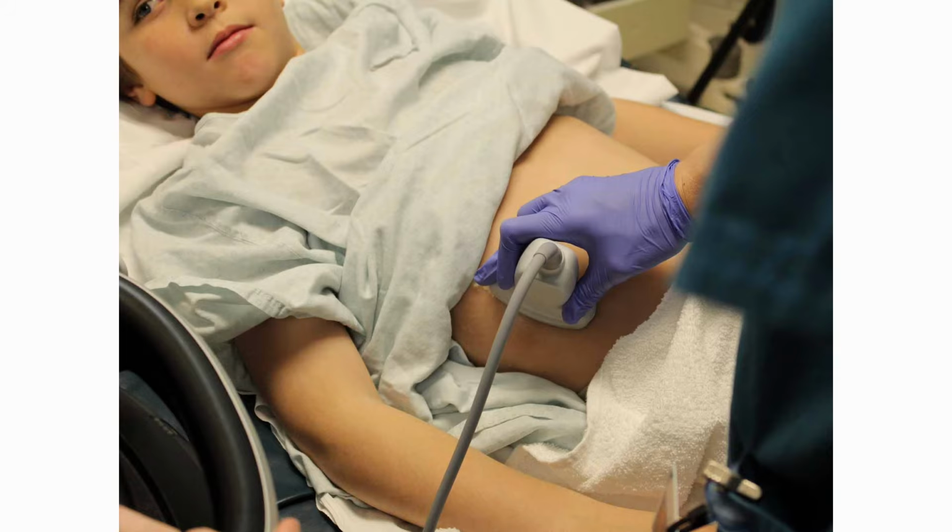Here we're using the curvilinear probe. With the probe held like a pencil, the sonographer has the ability to rock or rotate the probe. You can also hold the probe underhanded with your knuckles on the bed if the child's anatomy is more posterior.